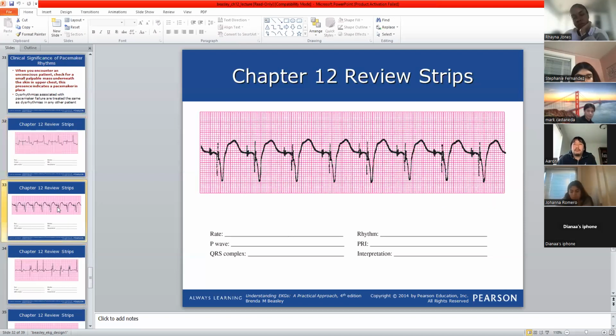And we have another example here. Can you go by yourself, Mark, to identify this strip? Yeah, I can try. Okay, try. Good job. I will help you. What is this? That's a spike. What is this? Another spike.